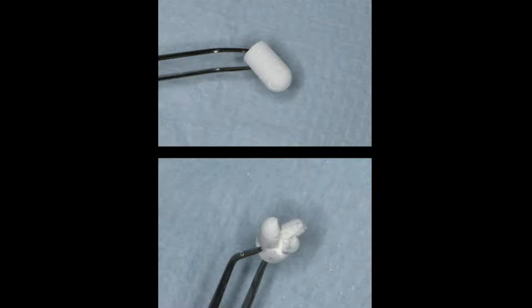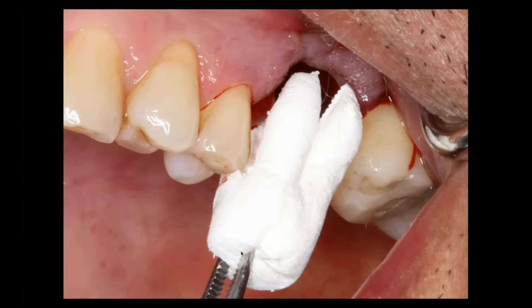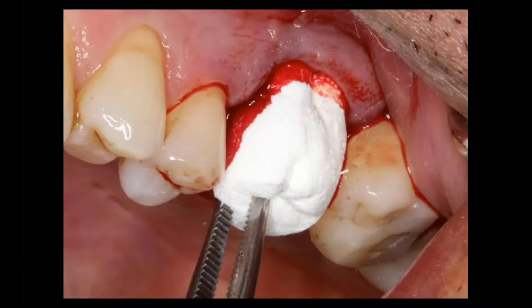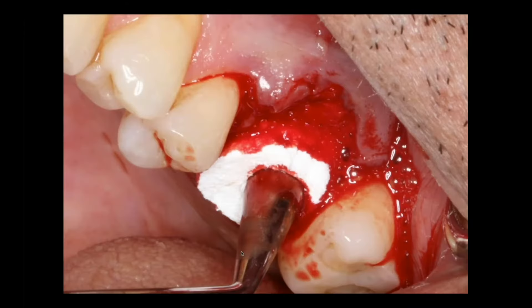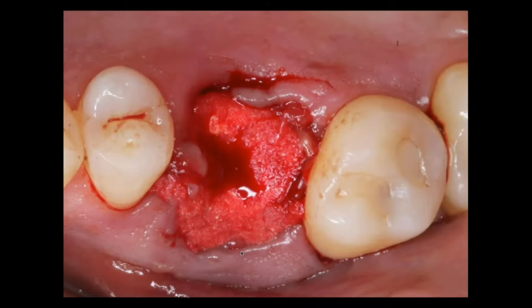You can see I actually cut it to make it look like the root of a tooth. Once it's cleaned out, you can see I'm taking my Osteogen plug that's been trimmed into three pieces. And you can see I'm slowly just placing it into the socket, and it's absorbing the blood.